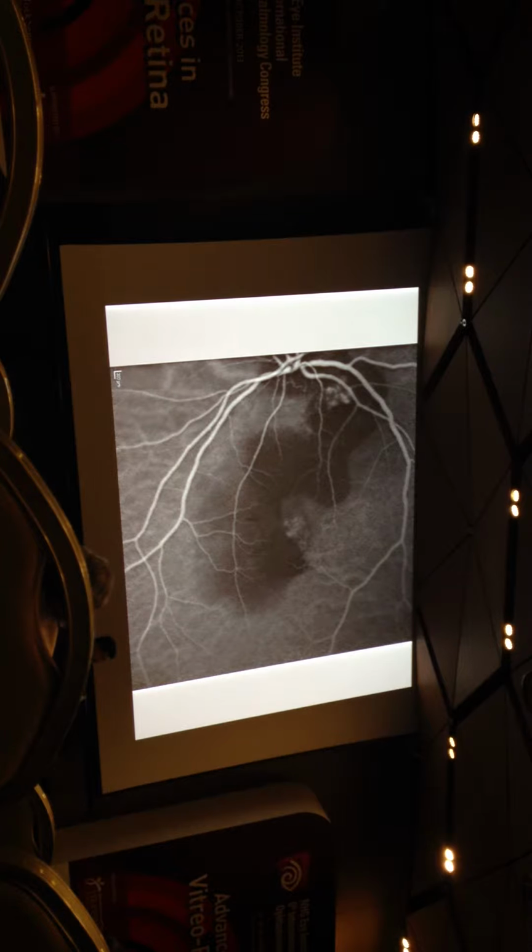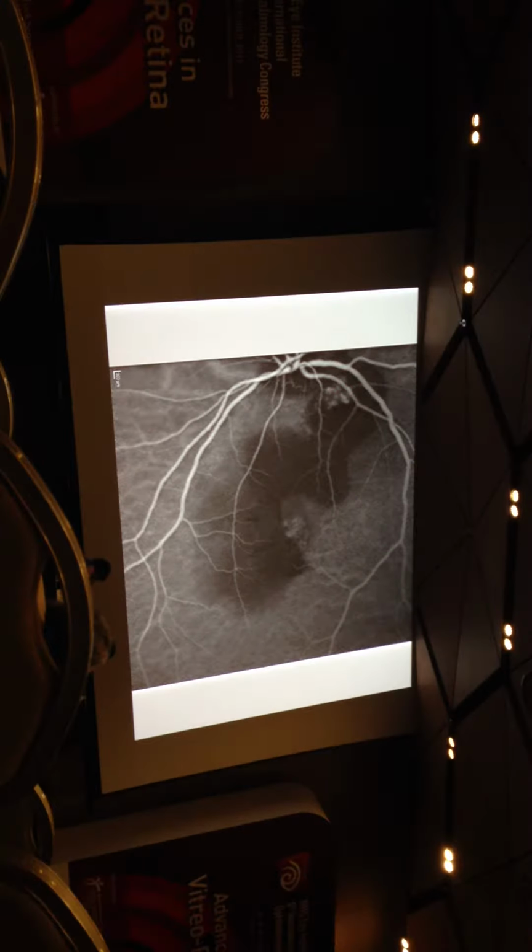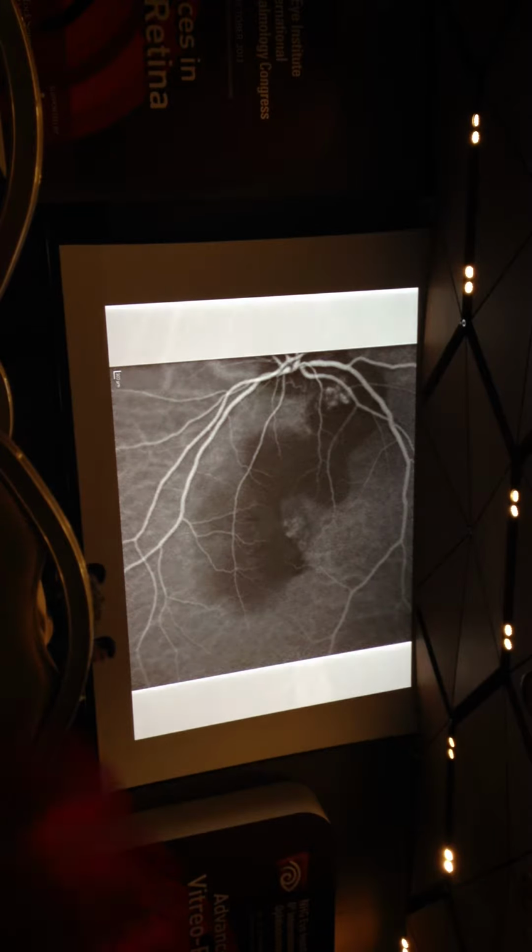I could say it was unexpected, looking at the retinal pigment epithelium detachment in the center of the fovea. I actually went back to see if there was some lesion over there at the beginning, creating that detachment, but I was not able to find it.